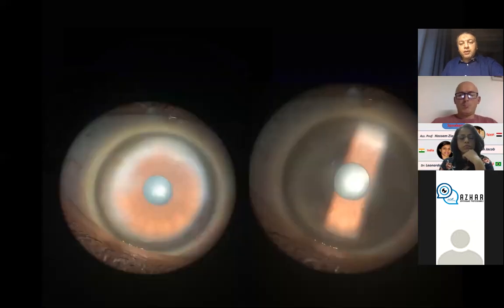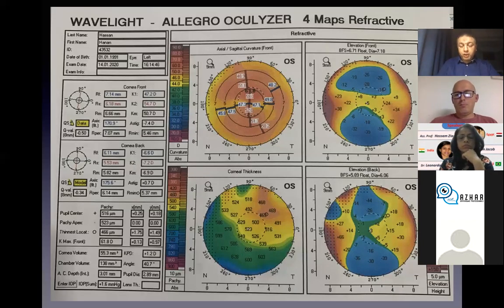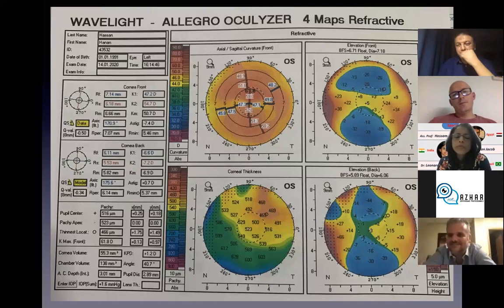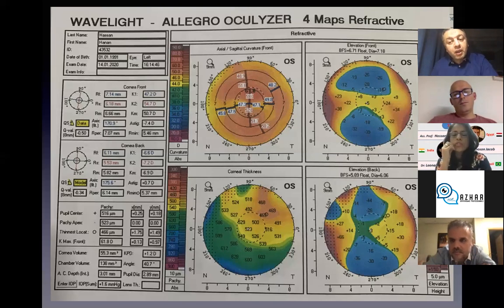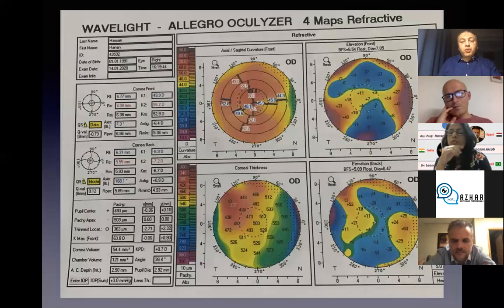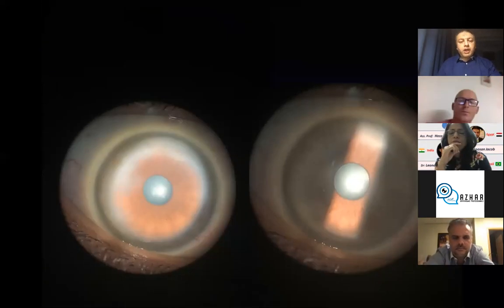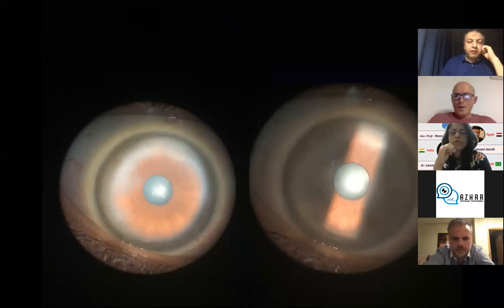So let's go back to the Pentacam. What do you think? Is there some peripheral degeneration or something happening in this patient? There is no history of any eye disease. On clinical examination, there's nothing; the whole eye is completely normal. Just these corneal white shadows all over the periphery and mid-peripheral parts of the cornea.